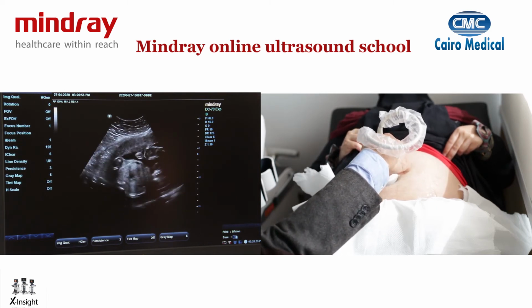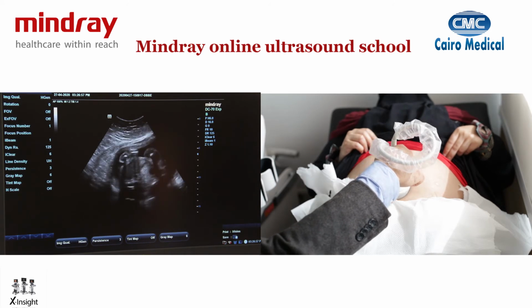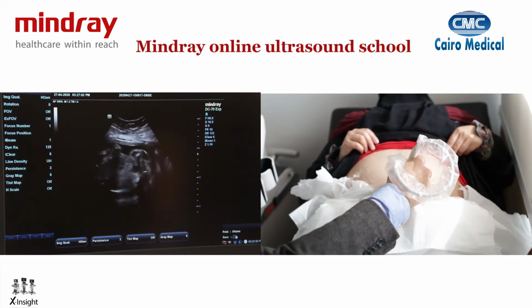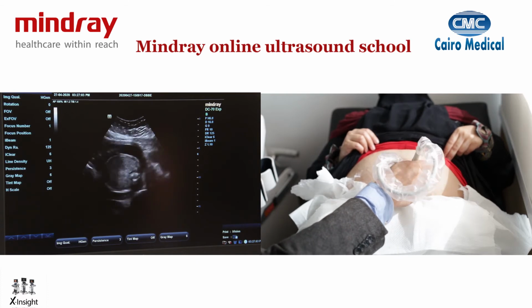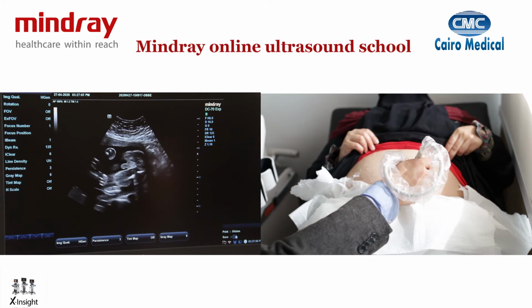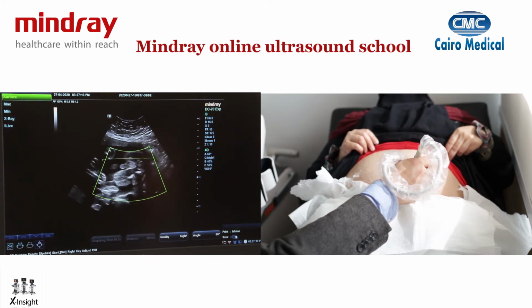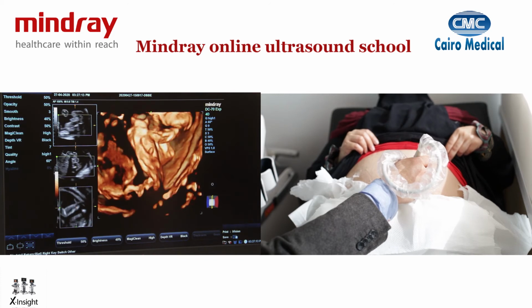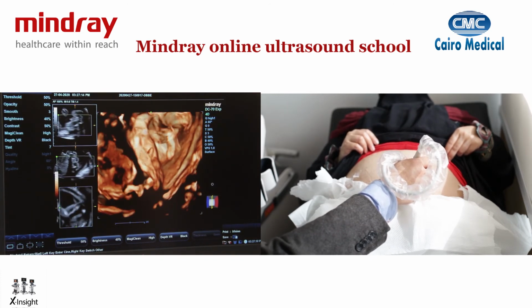I can see here the heart, stomach, and then below here I can see the baby's bladder. Okay? And between the legs, if I flip again at a 90 degrees angle, I can actually get the gender. So I can actually look at the gender by surface rendering. So if I put 3D, 4D and apply it here, you can actually see clearly that it's a male.